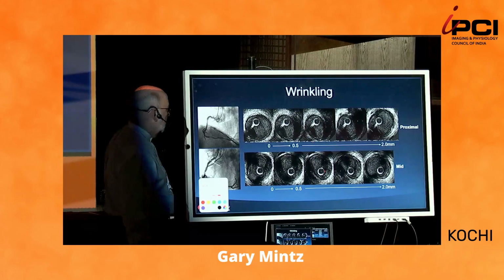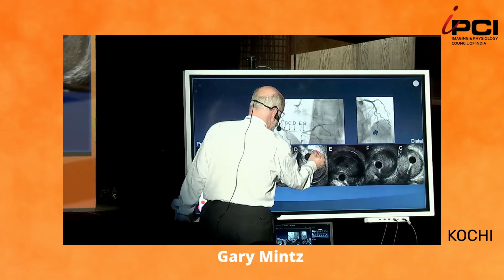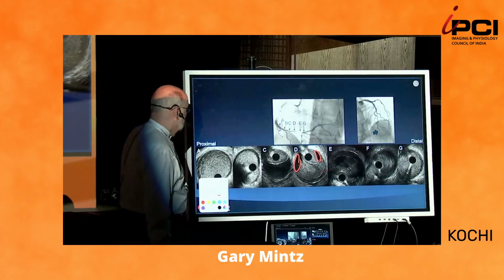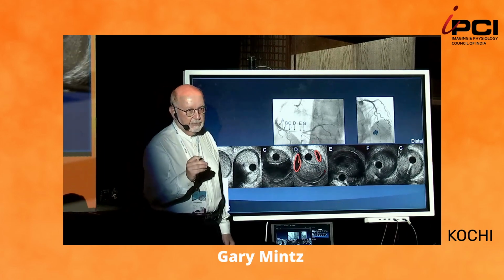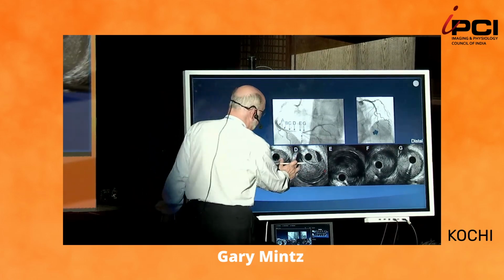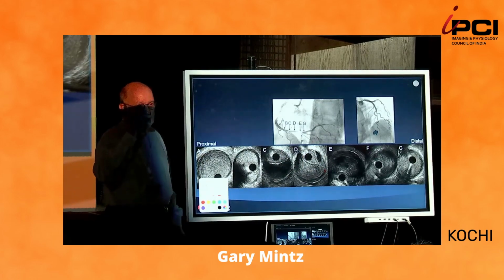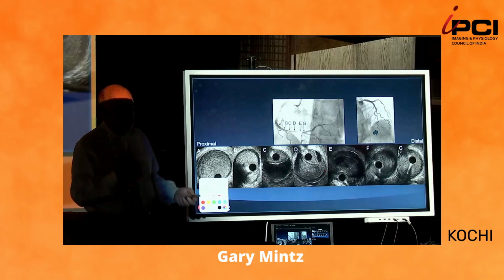But the other thing you sometimes see in here, you see this? What is this? What's this? That's most likely just contrast that you've injected, saline that you've injected, or the hematoma has separated into cellular and non-cellular elements. And anything that's black on an ultrasound is homogeneous in its density. And so blood is heterogeneous, saline, contrast, serum, plasma are homogeneous.